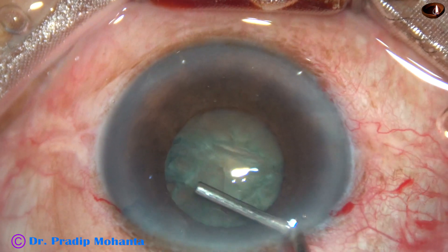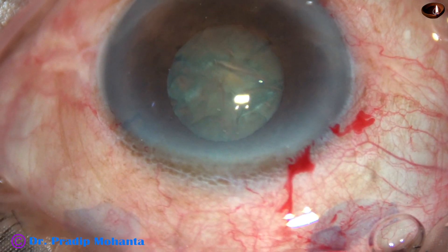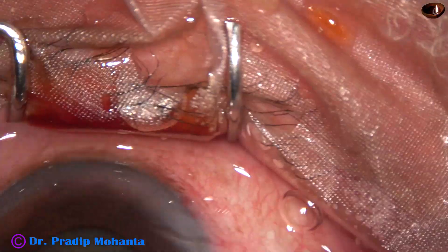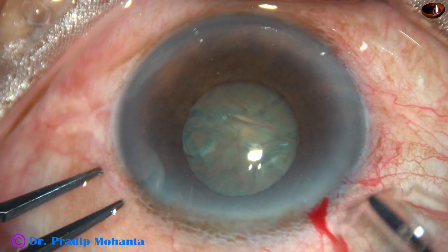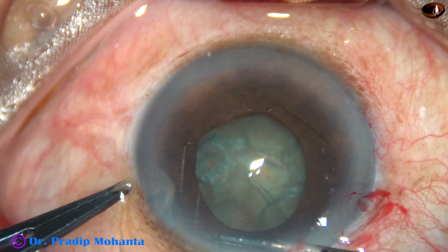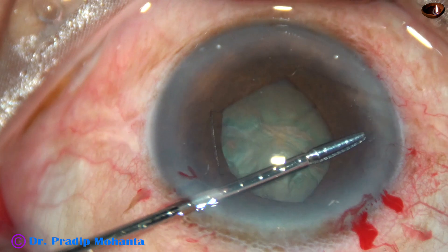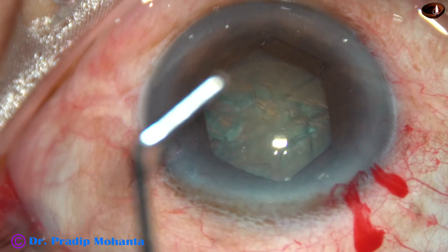So I have decided to use a pupil expansion device. The device I am going to use is B-hex pupil expander, invented by Dr. Suven Bhattacharji. It's a beautiful device — it doesn't need any injector system for its application or removal. The forceps being used for its application is B-hex forceps. I take the device completely into the anterior chamber and tuck the leading flange at 6 o'clock, then tuck the flange at around 1 o'clock, then use the left side port and tuck the flange at 10 o'clock. The flanges with tabs are being tucked underneath the iris.